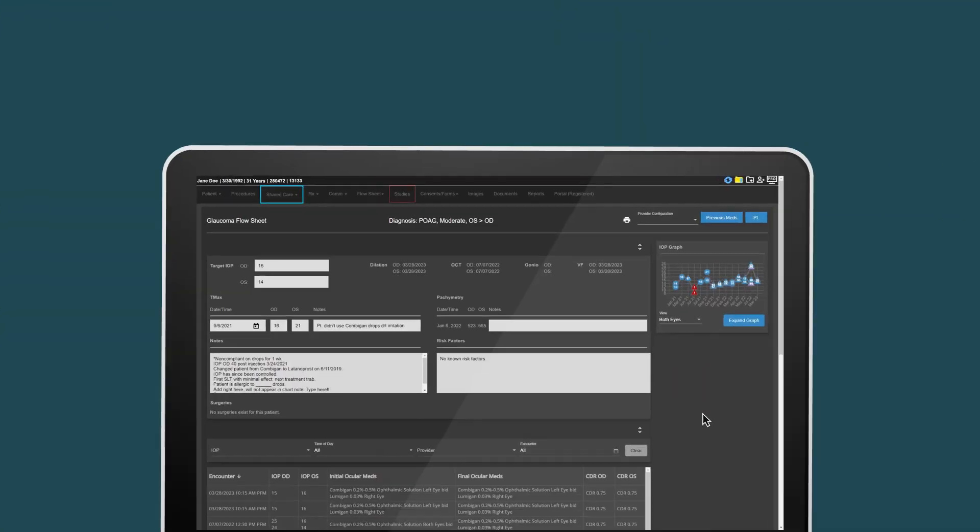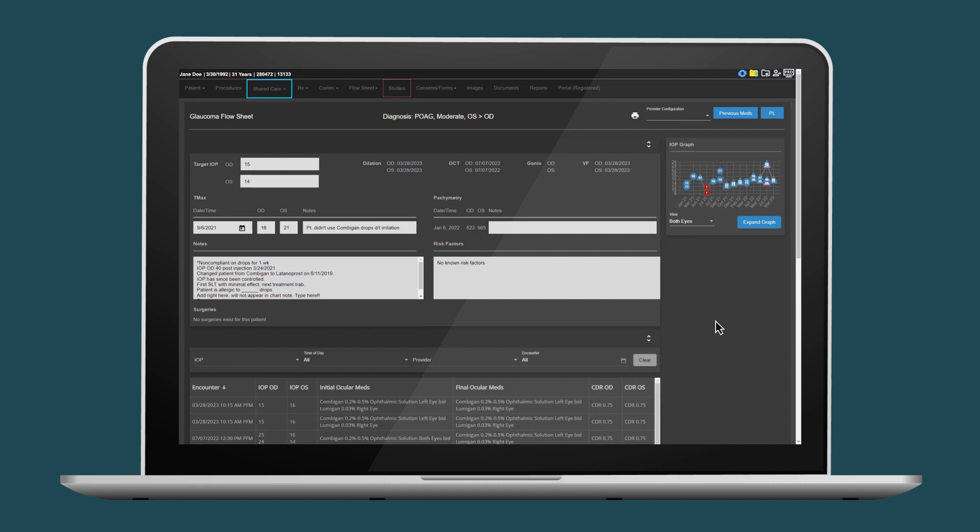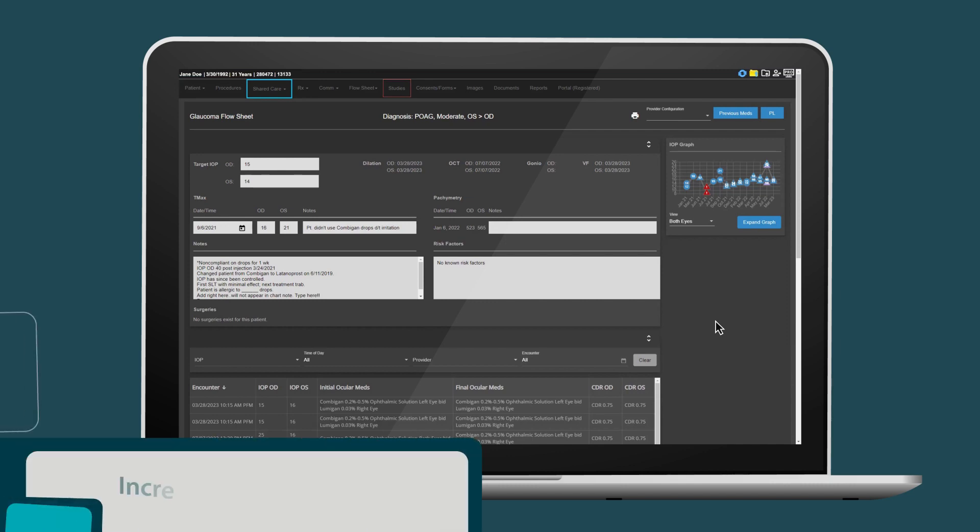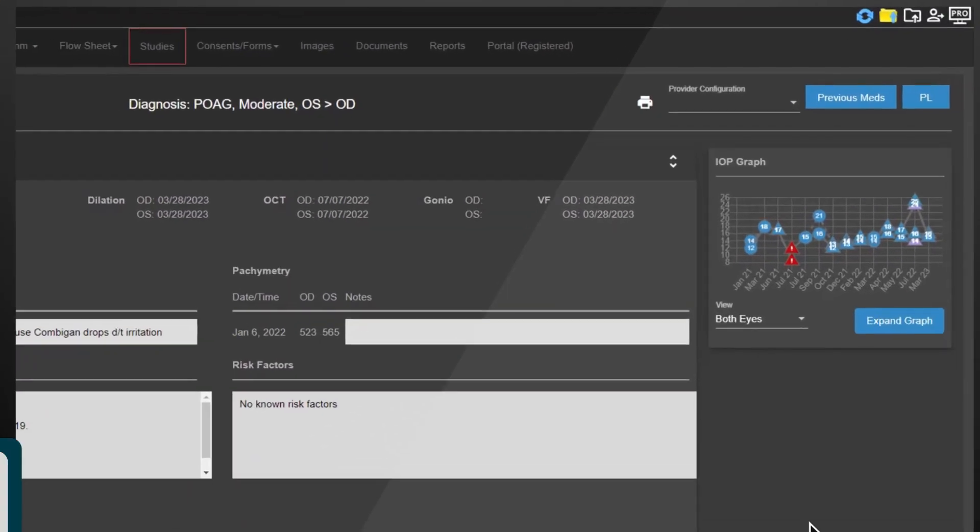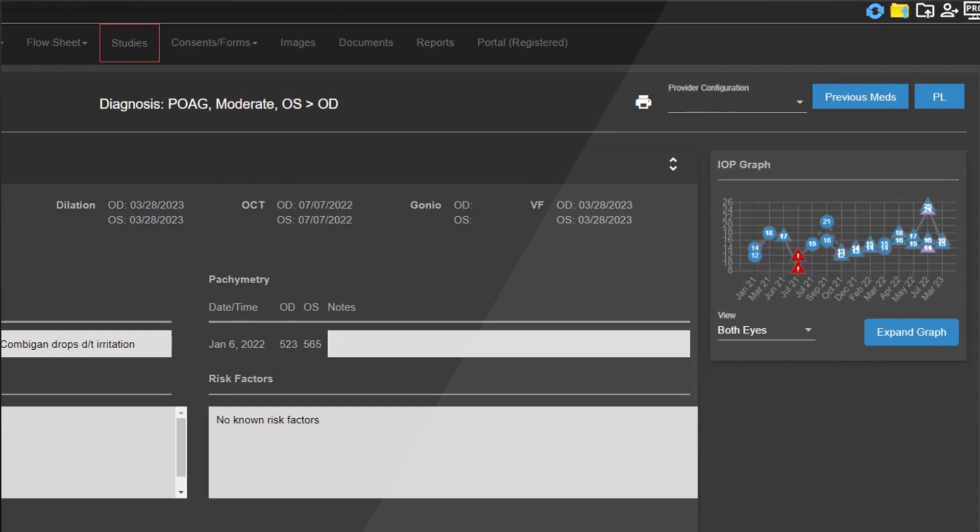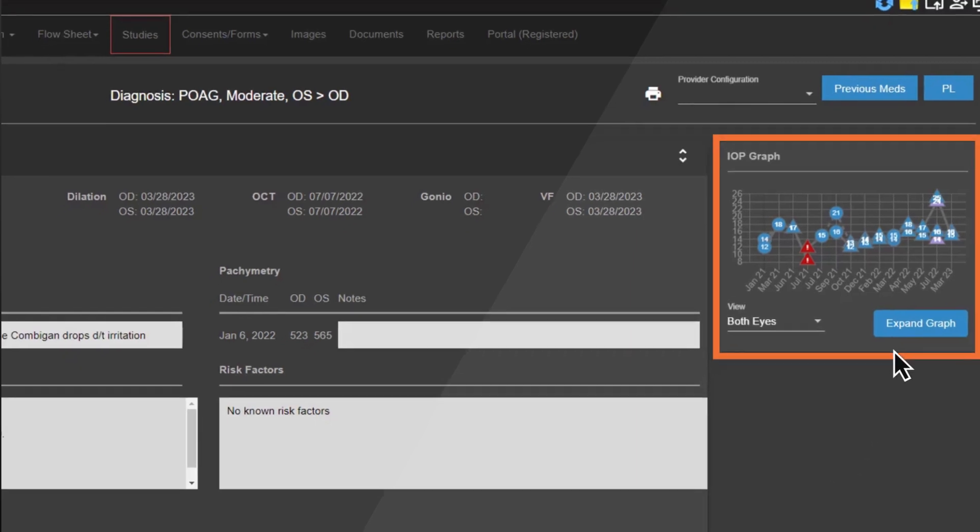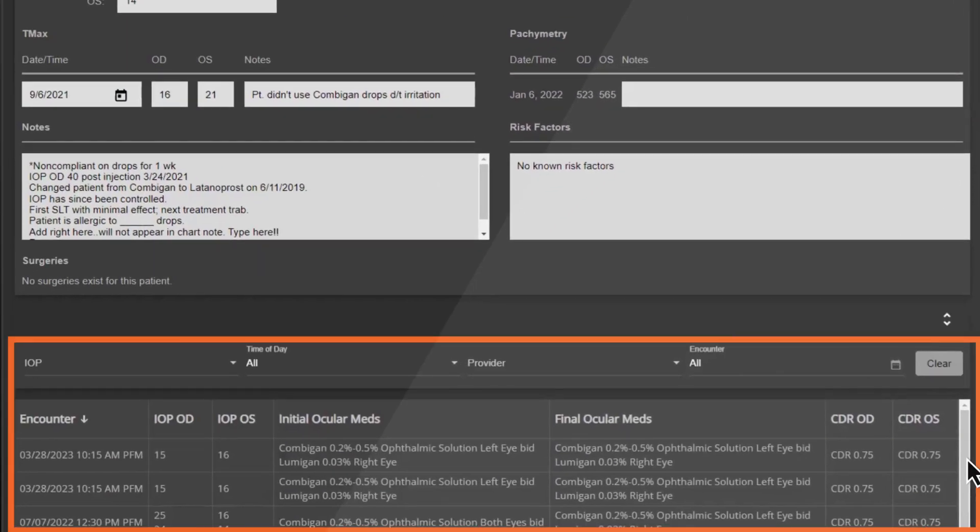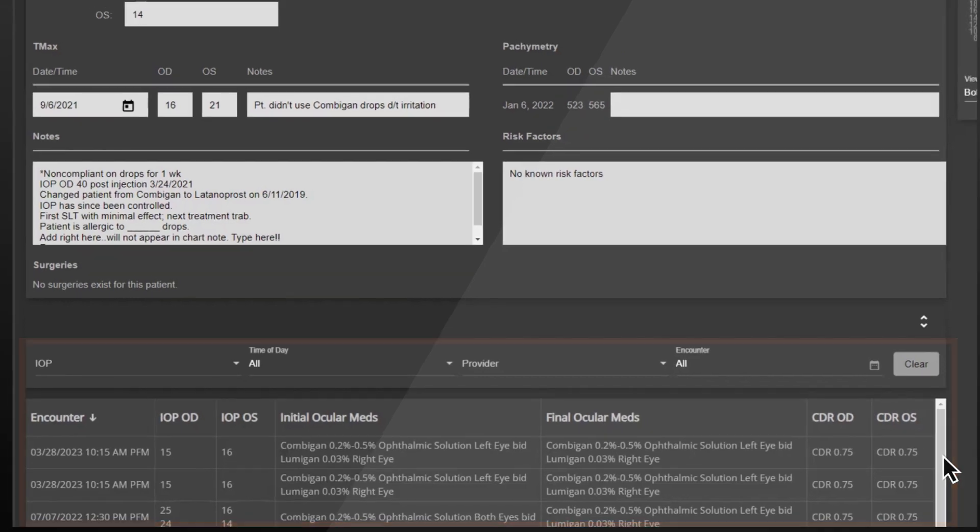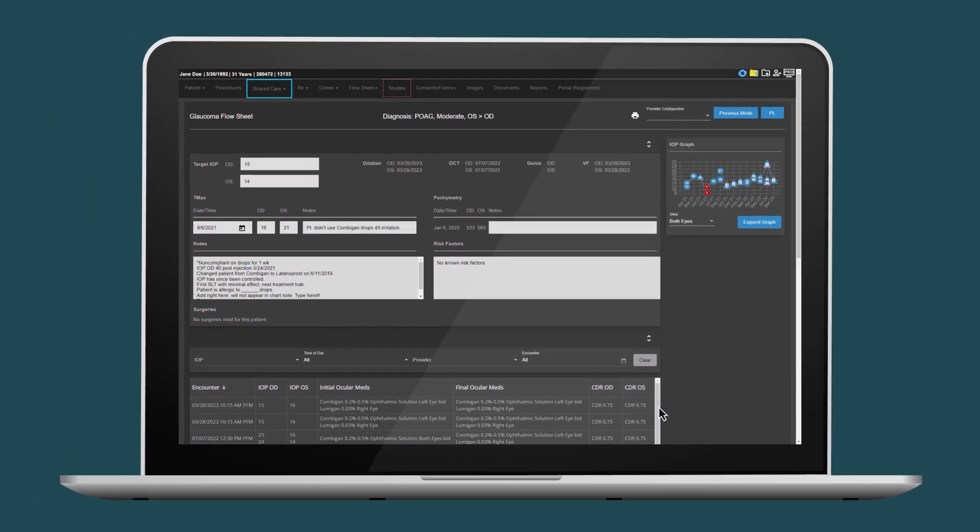Nextech's glaucoma-specific profiles and flow sheet increase efficiency and improve documentation accuracy by providing a longitudinal view of pertinent data, images, and patient progress over time, all on a single page from directly within a patient's chart in the EHR.